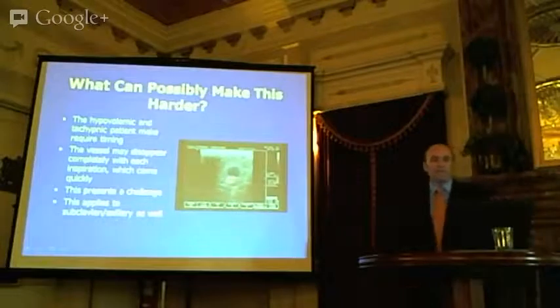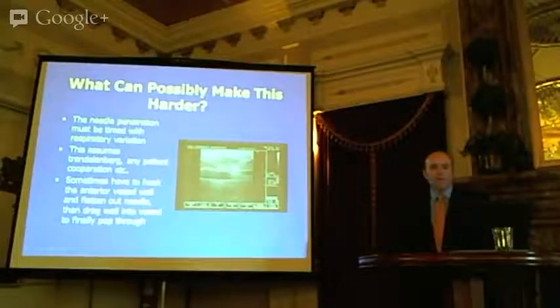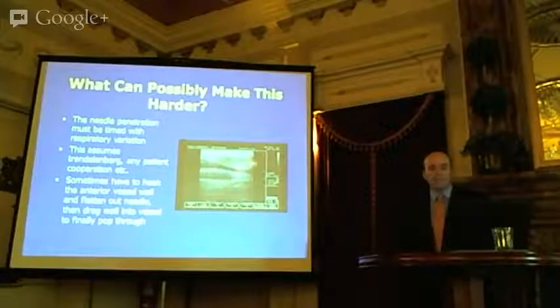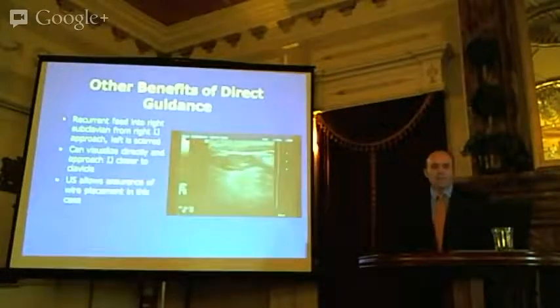This is also a tough one. Try this in short axis. Very tough. It's there. No, it's not there. So for timing, same patient, if you want to time this cannulation, you're probably going to have to come in long axis and wait for the patient to somehow open up their IJ just enough, flatten that needle, and you'll eventually be able to get it in and really get it successful in that case.